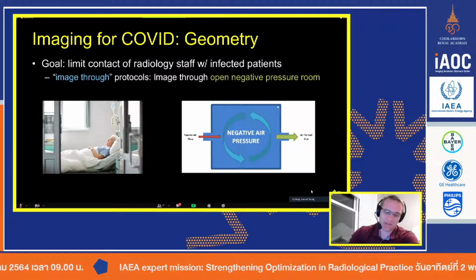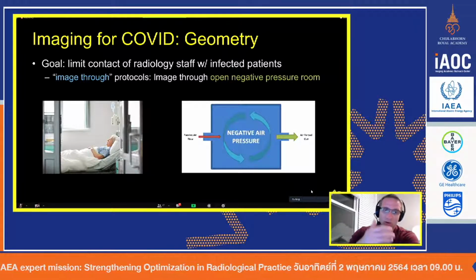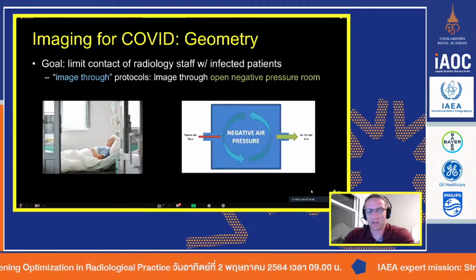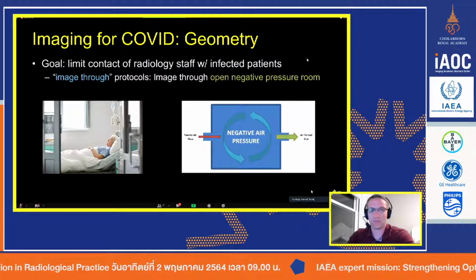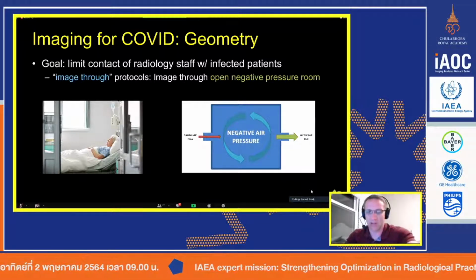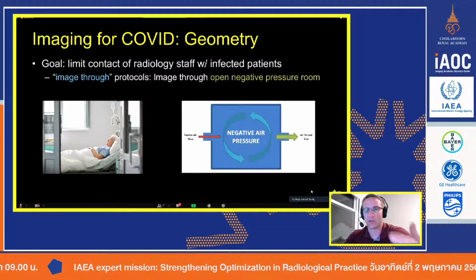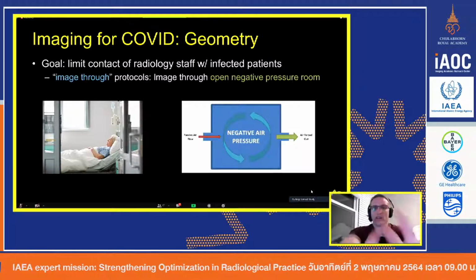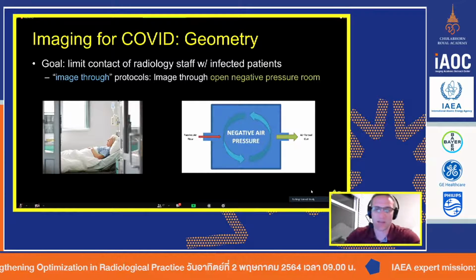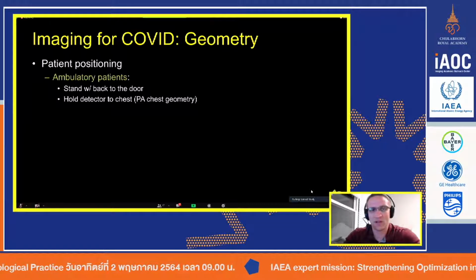So, this is probably the most ideal situation because you're not actually going through glass, but it's not ideal because you're still shooting outside. You're in the ante room, you're over here, whereas the patient's in the negative room, in the actual room where the negative pressure is. It's obviously allowed to have an open door because it's negative pressure, so the air is only flowing into the patient's room and not out to you. So those are the three major areas, or three major geometries, in which we're going to image.